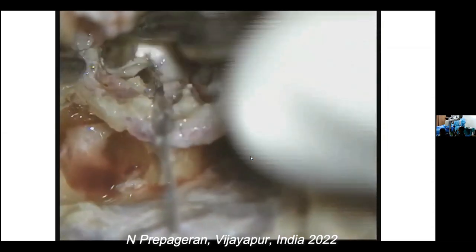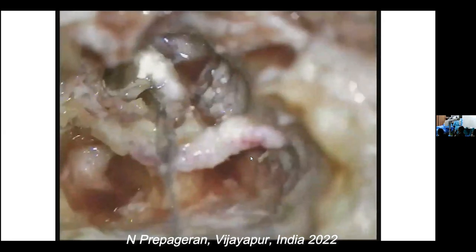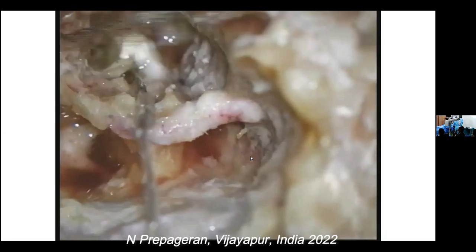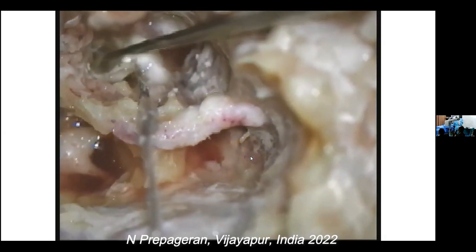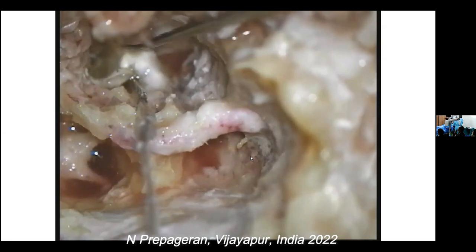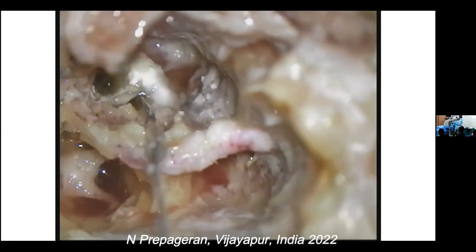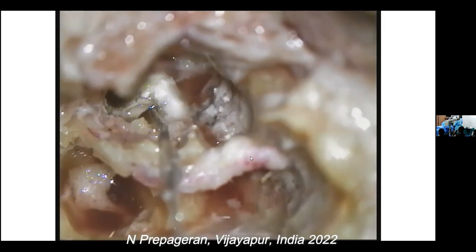So, who would like to come there? Beautiful. Can you see the basilar membrane? Okay, give me a pick. I can see quite nicely from here. I don't know about you guys, but I can see nicely. So, can you see the basilar membrane? Yes. Okay. Tympani, vestibuli and media here. Okay. Can you see the basilar membrane? So, this is your spiral osseous lamina. The future cochlear implant surgeons, please come and have a look.